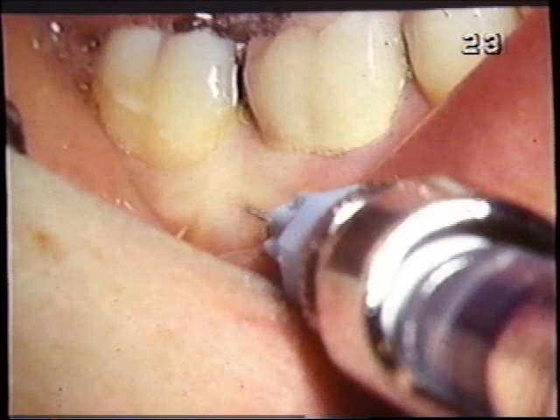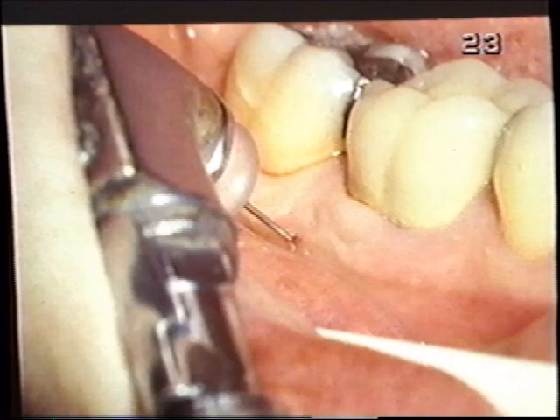Once we've anesthetized the mucosa with the topical, then what I'll do is take this needle that comes with the kit and blanch the soft tissue. Then it's a matter of putting that little drill that you saw earlier in your contra-angle, and at a point between the roots, use that little device, that little drill if you will, to penetrate through the mucosa and press on cortical bone until it breaks through.